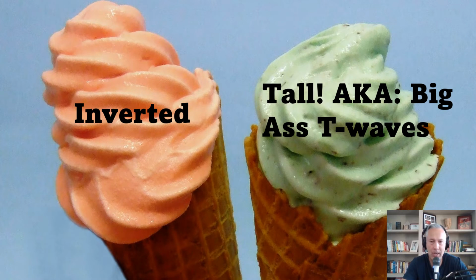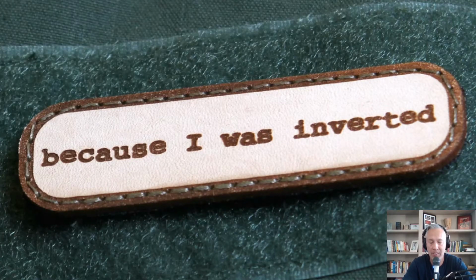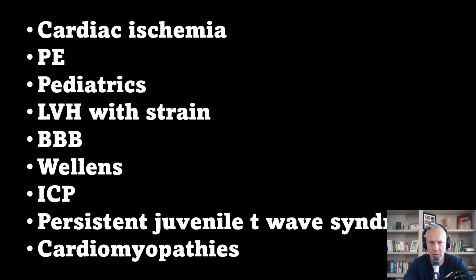All right, so the T wave comes in two flavors, so to speak, either inverted or tall, what I like to refer to as the big ass T wave. So inverted and tall. Let's talk about inverted T waves first. There are lots of different reasons that the T wave could be inverted. It could be cardiac ischemia, right?